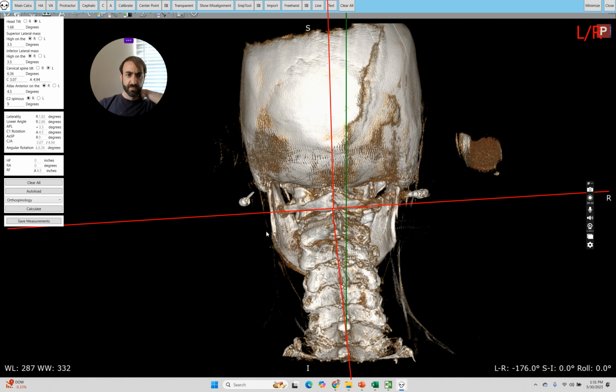And I'll use these in my report of findings, I'll show you in a minute, to present to the patient. I like to look at this before I adjust to get, okay, look at how much tilt there is to the left. If we take the head piece this way, if we tilt the head piece this way, if we bring the shoulders, it helps me visualize my adjustment before I do it, which I really like.